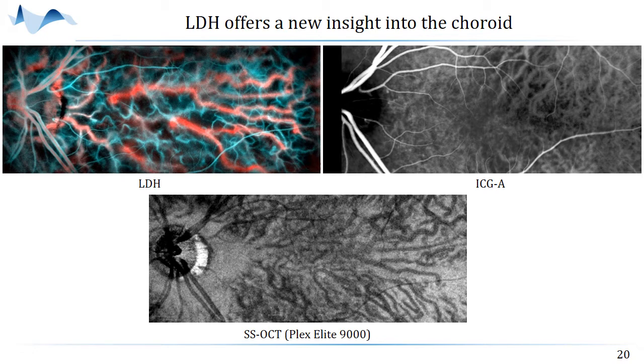the vessels that appear in cyan, they are not veins but they are actually arterioles, and we are certain they are arterioles as they cannot be venous because we don't detect the veins. So as the flow in the venules would be even lower than the one in veins, we cannot see them.